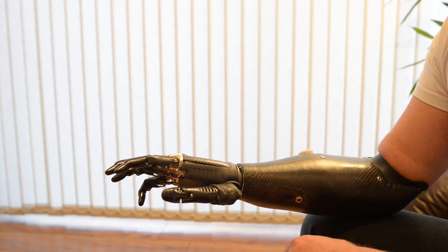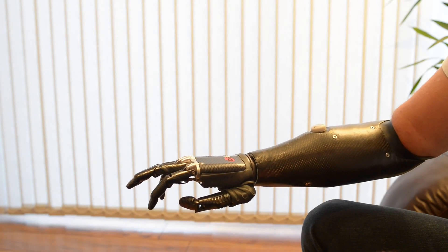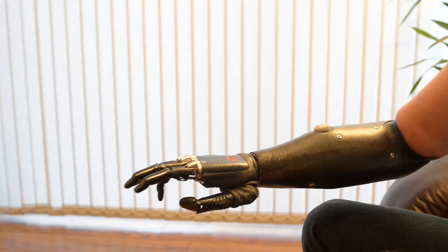And then we have a mouse grip. This will hold a mouse — single click, double click. And they're developing this now so that you'll soon be able to drag and drop.